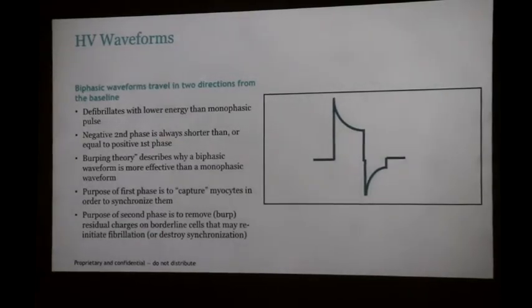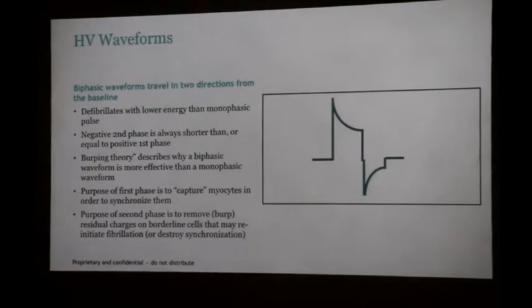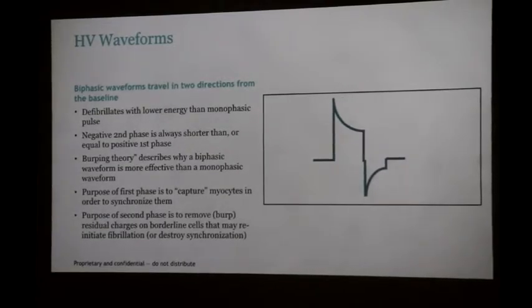Backwards. At the back, right? Yeah. So it's pulling current into the back of the heart, right? So this is the rationale of putting an azygos lead. The azygos lead is a great lead if you have high defibrillation thresholds, or put the lead on the septum. Yeah, but the azygos lead is really nice.